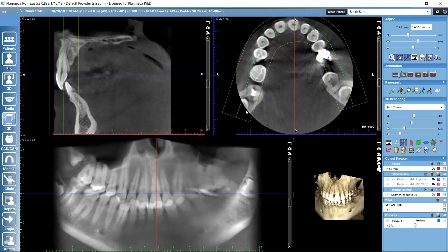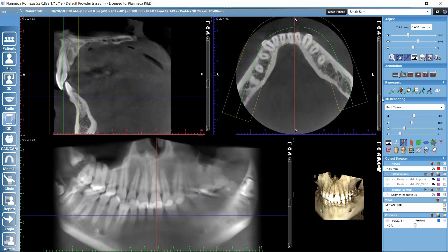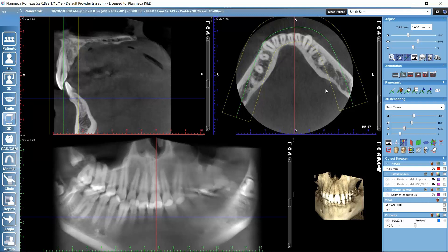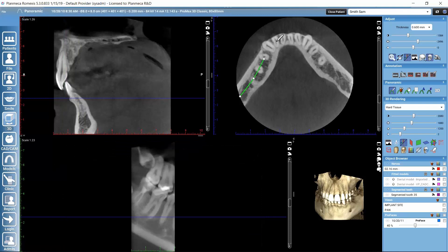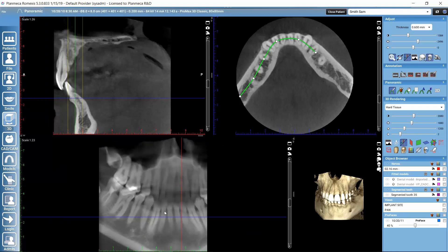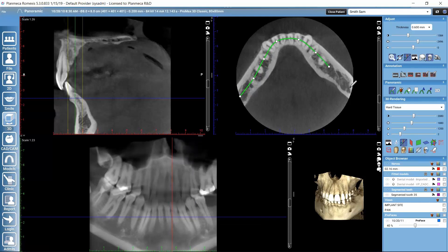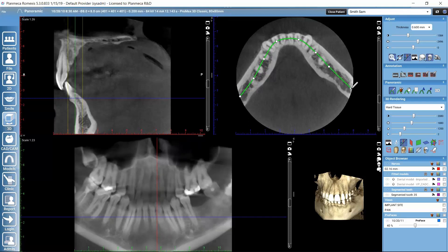Naturally, if we would like to adjust the view — or get just half of the arch, for example — or define the curve manually, that's also possible. We can start by adjusting the axial view so that we get the panoramic curve drawn on the slice we want, then activate the first icon for drawing a panoramic curve. In the axial view, we can click with the left mouse button to define the curve, then finish with the right mouse button.